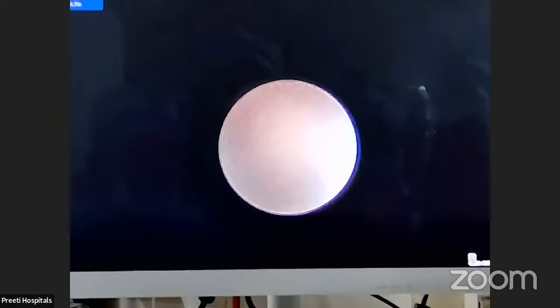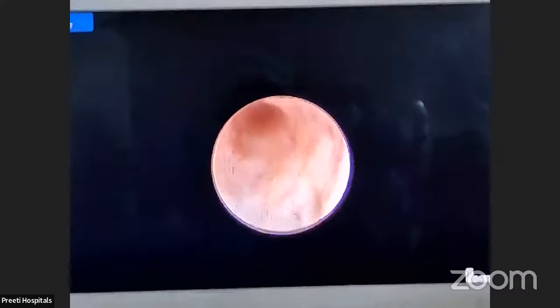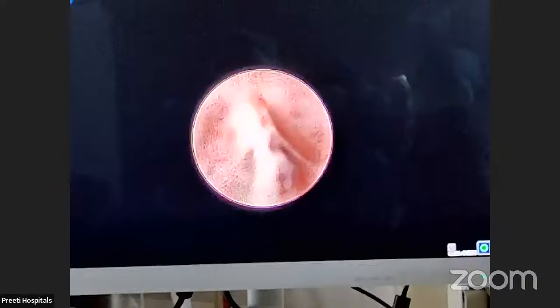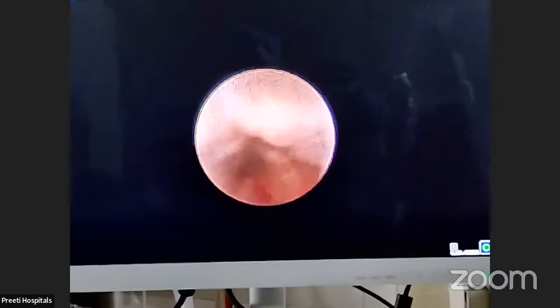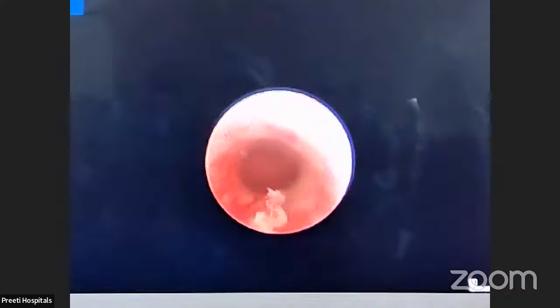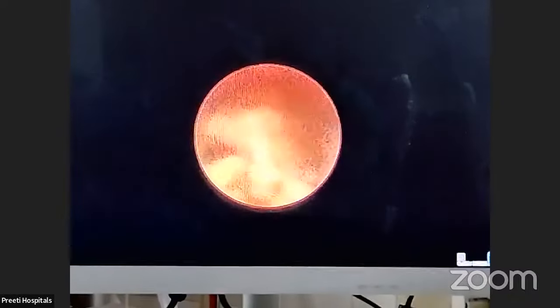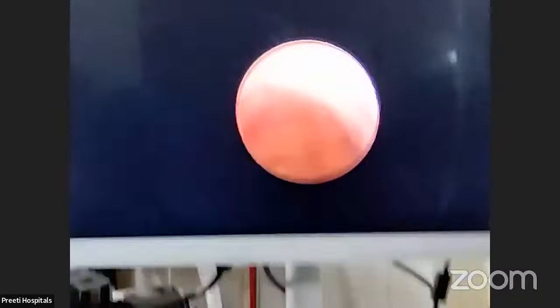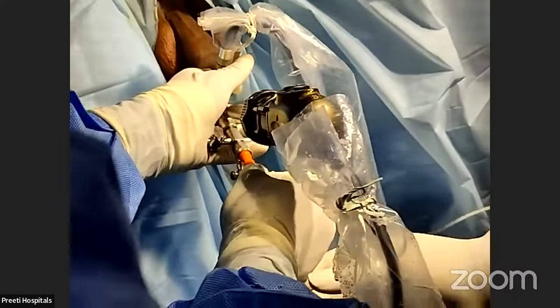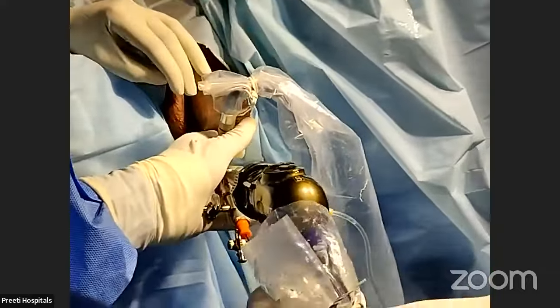Whenever you put a stent, a certain amount of trauma will be there. When you do RIRS, we see that small clots will be there. And you can see the ureter nicely there. This is the stent. And now we will almost see, I am inside the calyx. Inside the calyx, I am seeing the stone. So what I will do is pass the guide wire, which is thicker. Always pass the guide wire which is thicker.